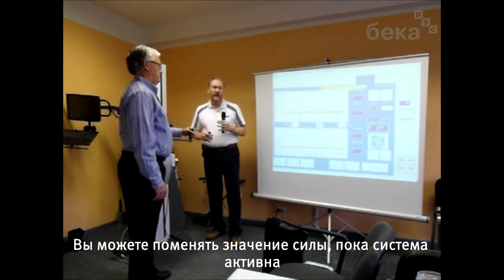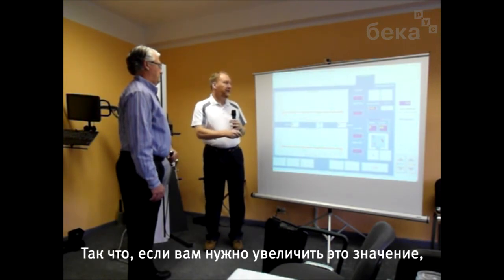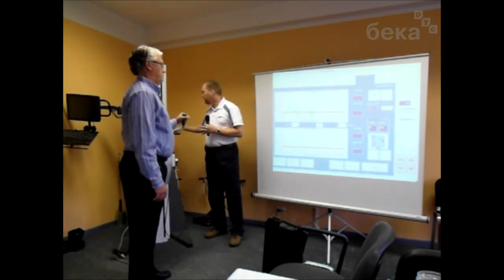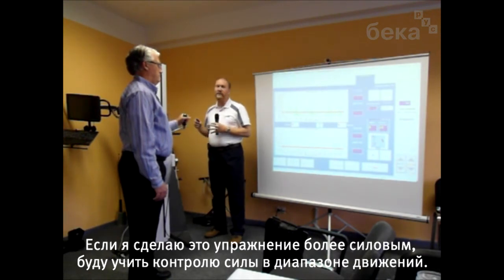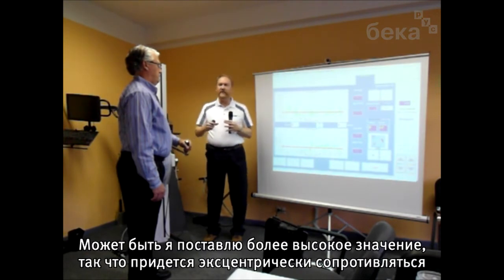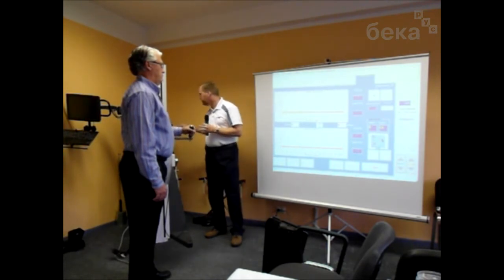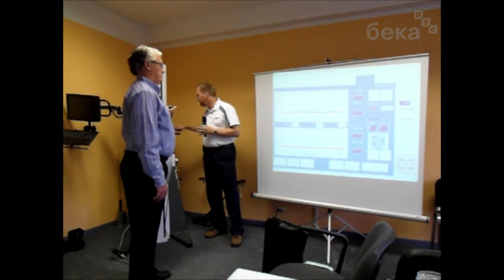You can change the target force while the system is active. So if you need to adjust this value to make it more appropriate for the individual, you can change it at any time. So if I wanted to make this more of a strengthening program where I'm teaching him how to control his strength through range of motion, maybe I want to set it higher than the weight of his limb so he actually has to now resist or eccentrically push against the tool as it's moving him through the range. So I'm going to set it to 15.